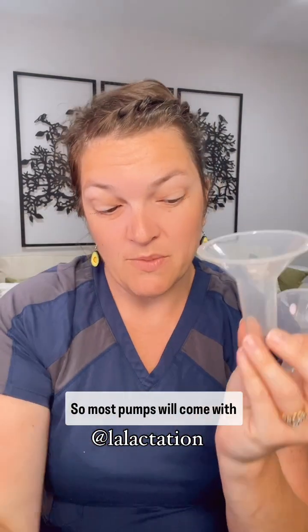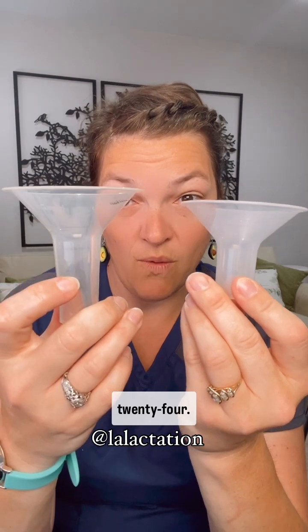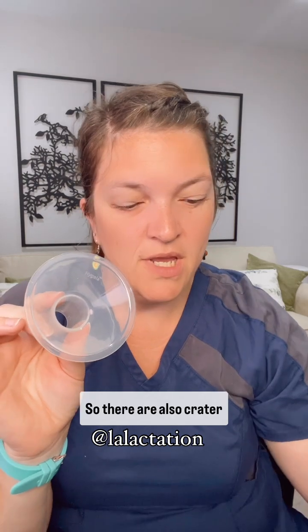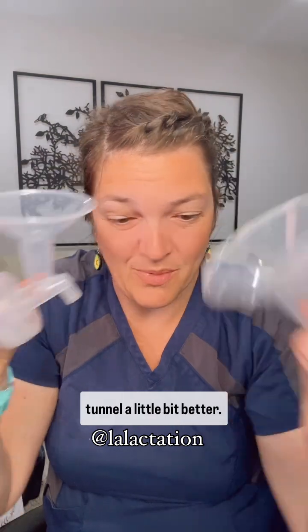Most pumps will come with a tapered flange. This is Medela's 24, this is Hygieia's 24. You kind of have to shove your breast in there to get the nipple into the tunnel. There are also crater flanges — the crater makes a softer bowl so that the breast kind of sits and cups into it. This is for your more round breast; it tends to get the nipple into that tunnel a little bit better.